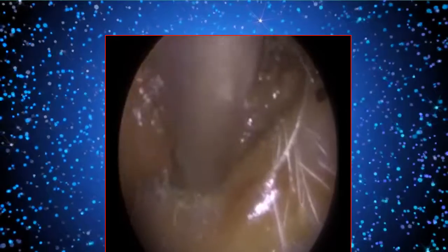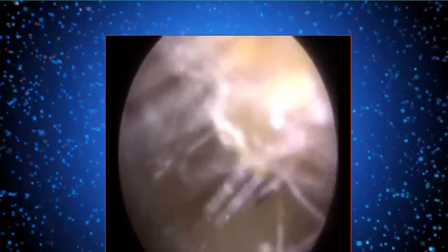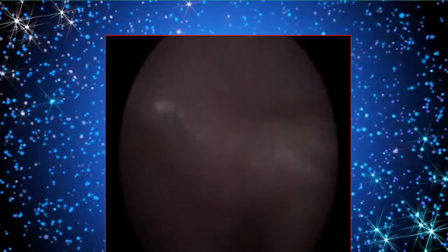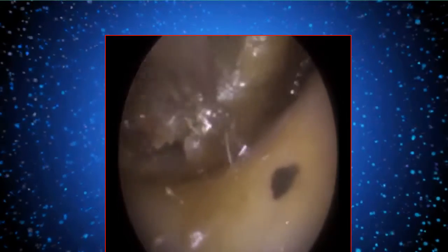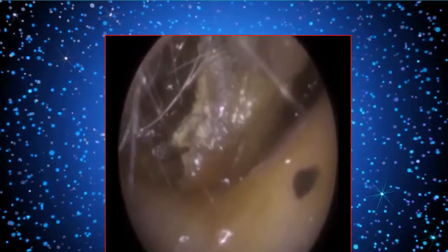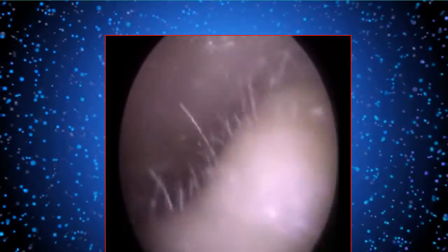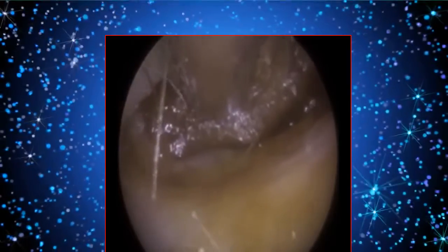The ear canal itself is quite narrow. I like to call it quite slit. So the natural shape of the ear canal should be almost like an oval. But in this client here, it's a bit more of an elongated oval. So it's a bit more slit, a bit more narrow. And that could be one of the reasons why this gentleman actually suffers some wax impaction. As the wax naturally is migrating out of the ear, it's getting trapped near this entrance where it can narrow slightly, then causing wax to build up behind it.